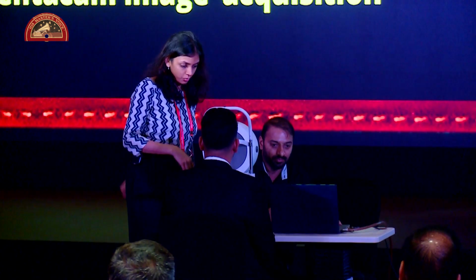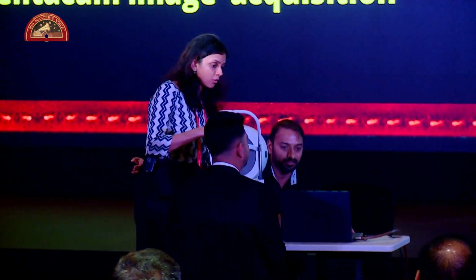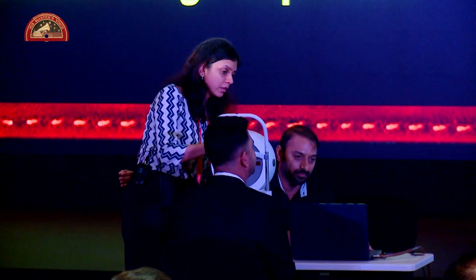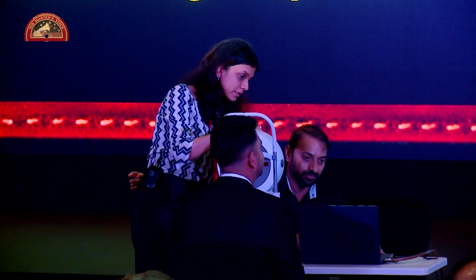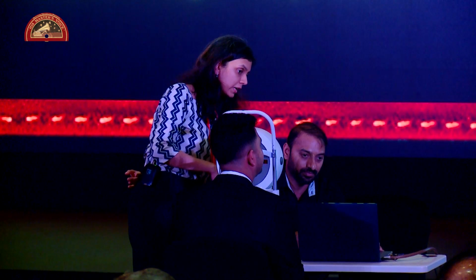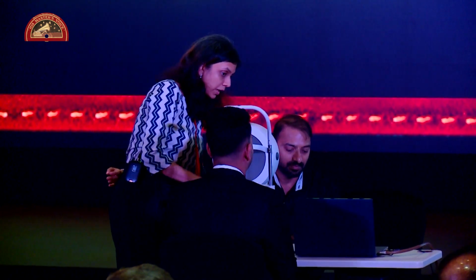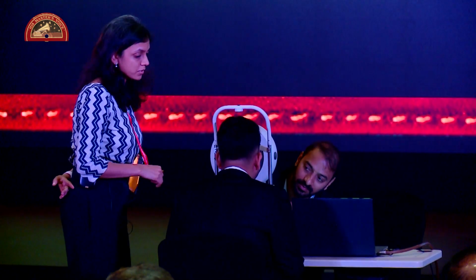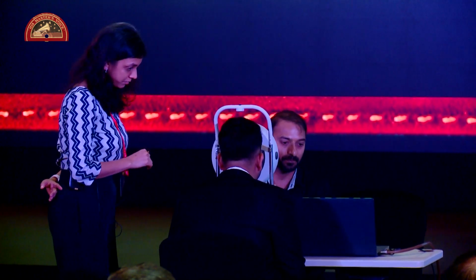Now, coming to how to acquire the scan. First, we enter the data of the patient. Once the data is entered, we click load the data, and then we click on scan. Once this has been clicked, the patient is made to sit comfortably on a chair in front of the machine.